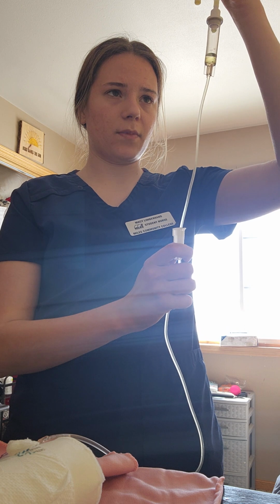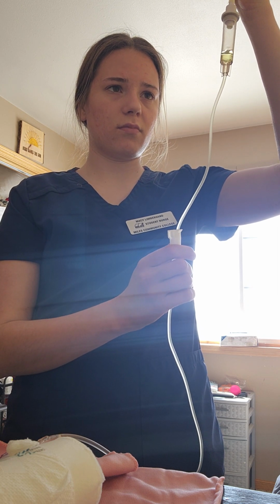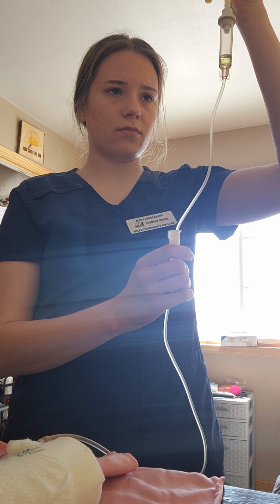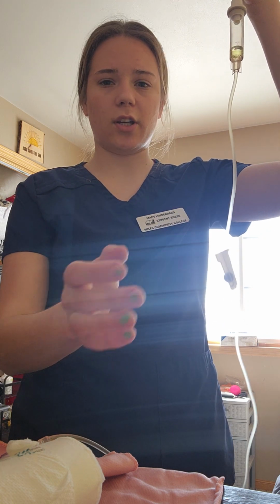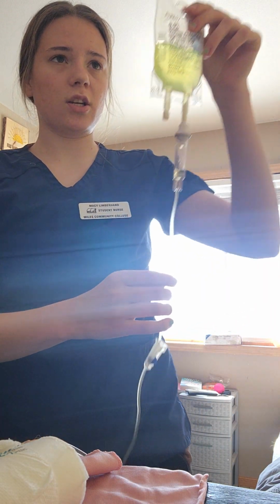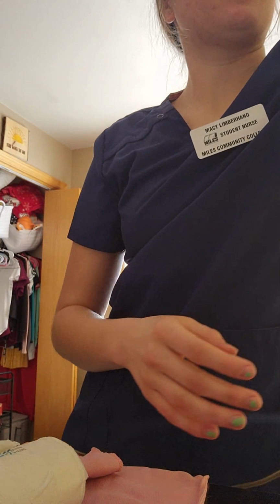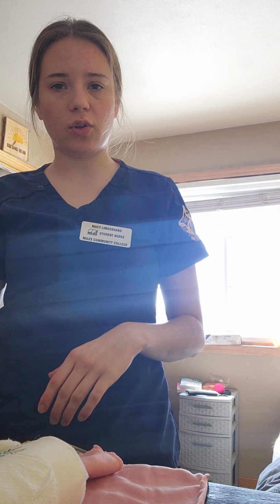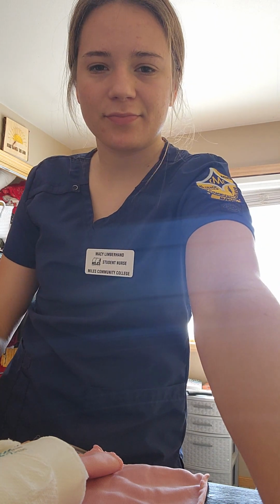Okay, that's way too fast. Okay, so I'm going to sit here and count for a minute. Okay, so I now have my infusion rate correct. So I'm going to hang this bag, and then I'm going to let it infuse for the full 45 minutes.